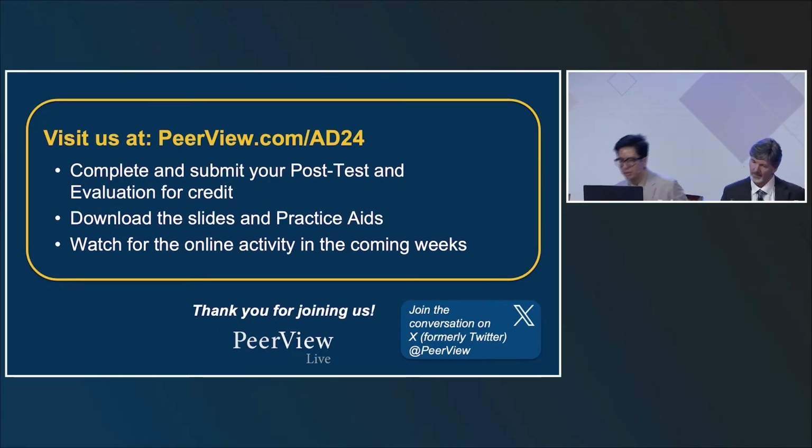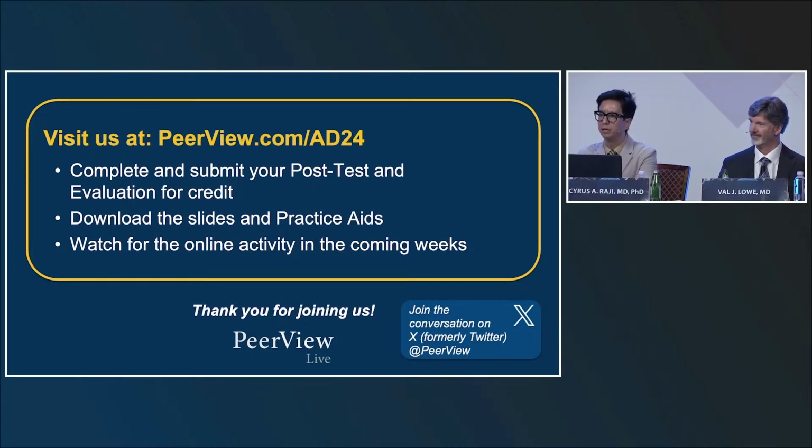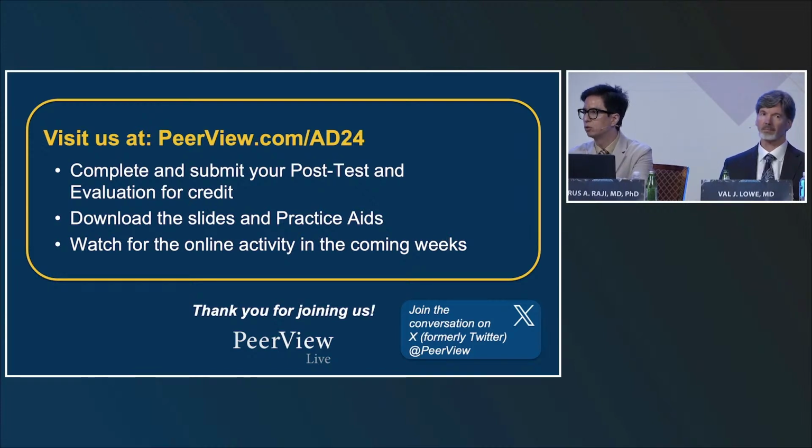I could take that question. Looking at the related edema changes and fluid shifts will be very important. This is actually already known in the MS world. In multiple sclerosis, there's the phenomenon of pseudoatrophy that can happen when you have edema. It's also important to understand that some of the volume loss may very well be happening because as we're clearing amyloid from the brain, clearing toxin out, we're clearing out volume essentially from the brain. Especially if you're seeing volume loss that's not as pronounced in, for instance, the hippocampus or cognitively relevant structures, I personally, in my own practice, would favor that to be more of a pseudoatrophy effect, especially if the related clinical picture of cognition is improving as opposed to declining.